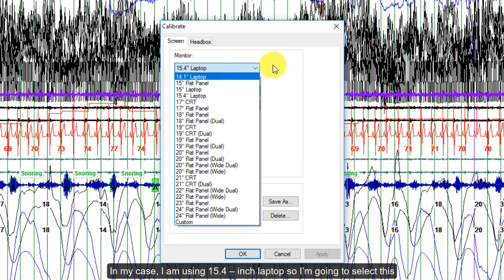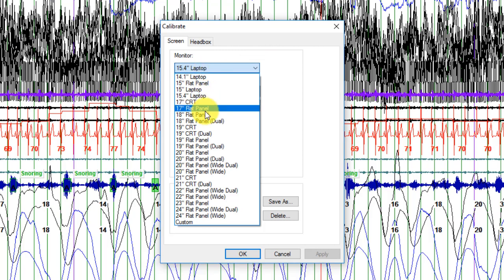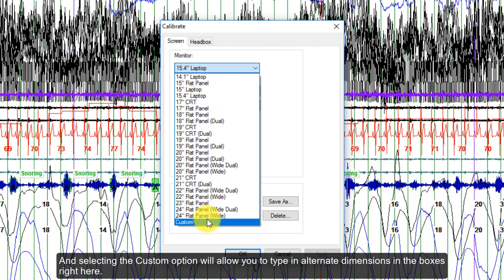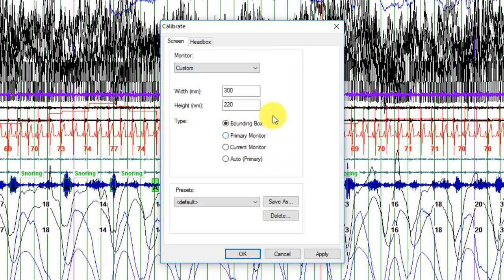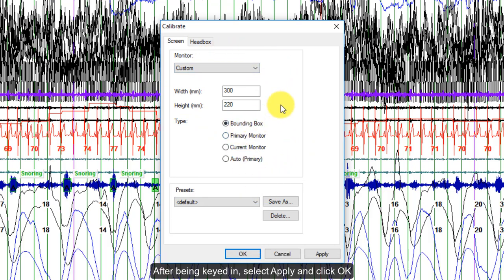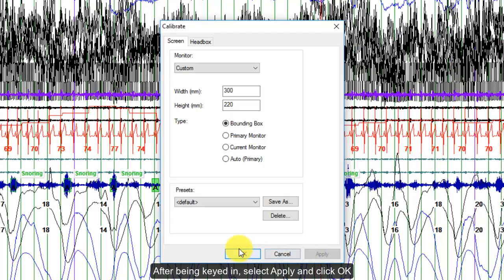In my case, I'm using a 15.4 inch laptop, so I'm going to select this. Selecting the Custom option will allow you to type in alternate dimensions in the boxes. After being keyed in, select Apply and click OK.